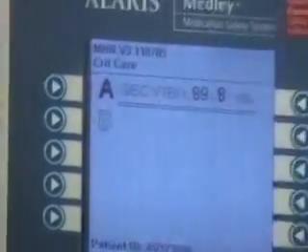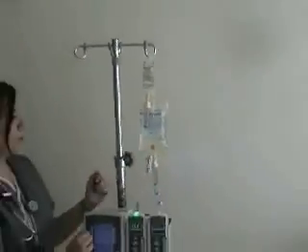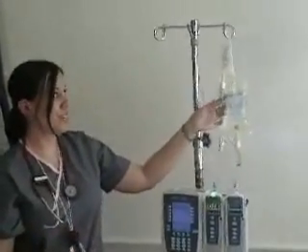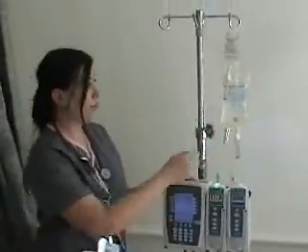It says pump A — this is pump A, and your primary line is hooked up to pump A right here. By programming the secondary, hooking it up, and leaving it higher than the primary line, the computer knows to run this solution until it's done — until you reach 100 mils. Then it automatically converts back to your regular line at 50 mils per hour, just exactly what we had ordered before.